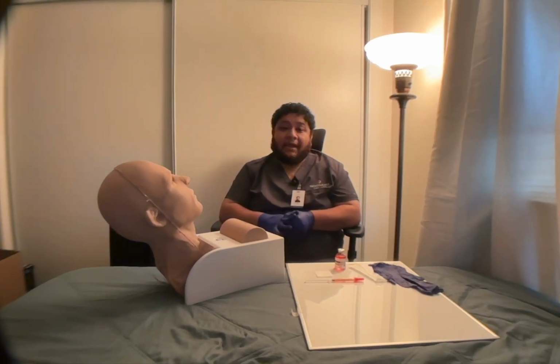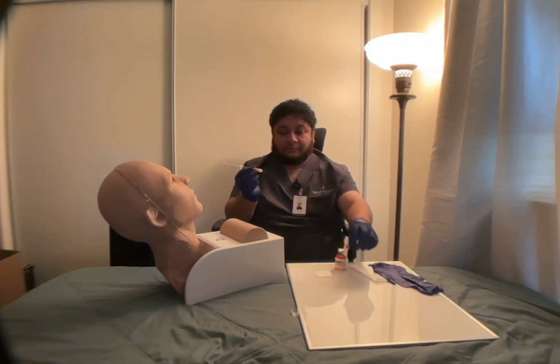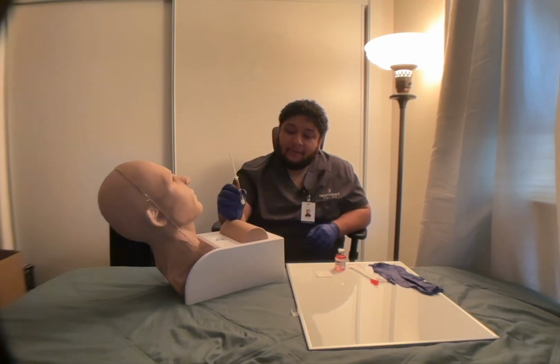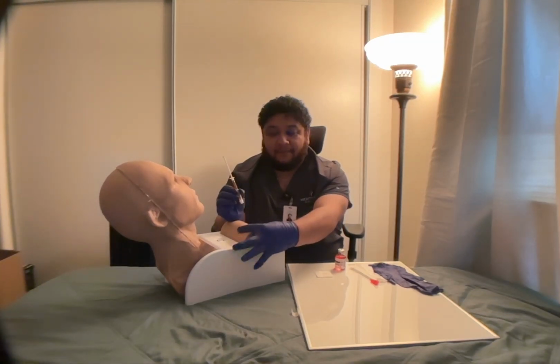Now I'm gonna go ahead and remove the cap from the needle. In the dart-like method, like holding it like a dart with my dominant hand this time, I'm gonna go ahead and place the palm, and then I'm gonna go ahead and pinch the skin like I did before.